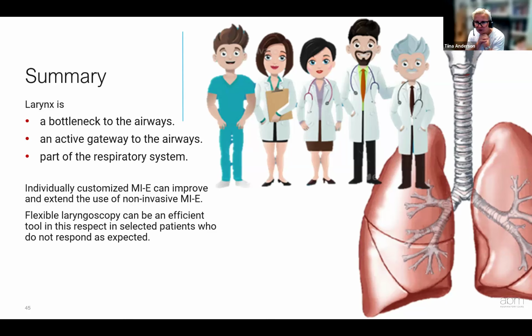And if we don't know what happens and we're really scratching our heads, we can use visualization of the upper airways during the treatment with flexible laryngoscopy. We can use laryngeal diagnostic ultrasound, if you are familiar with that, or just a simple stethoscope to listen to the flow. That could be the first thing maybe to start with.